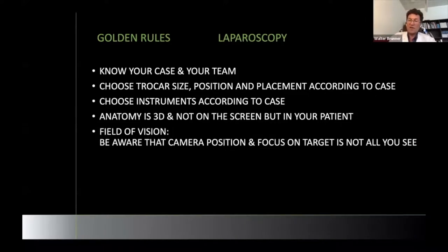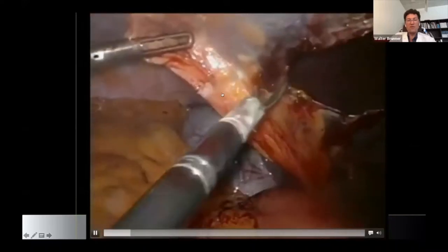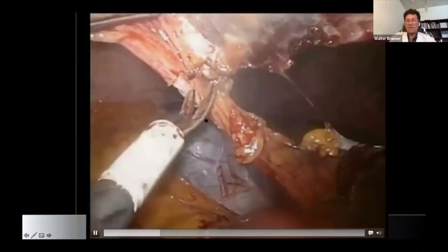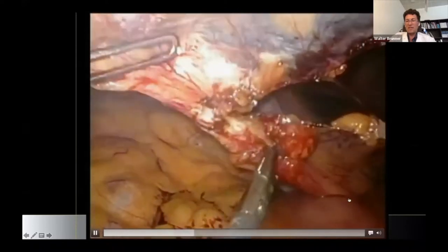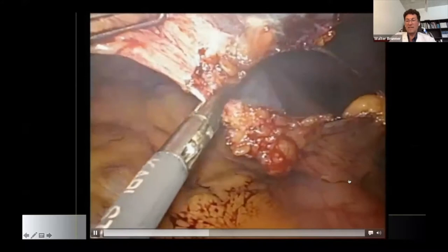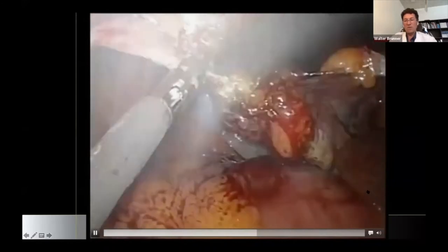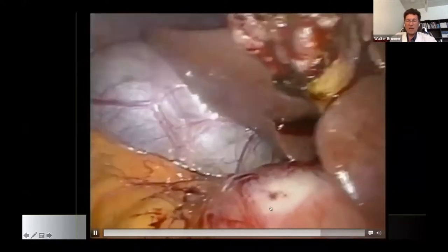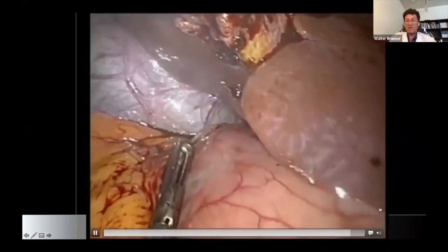Here's an example: during laparoscopy, you are focused on one part using energy, and maybe you're not looking at another part. When we cut the last small band using energy, the energy can reach another part that is in our field of vision but not where we're focusing. You can see what happens — if you don't look there, you don't realize it's burning somewhere else. There's a lot of smoke, so you might miss that another area was burned. Be aware that something can happen outside your target, and at the end of the operation you should check everything.